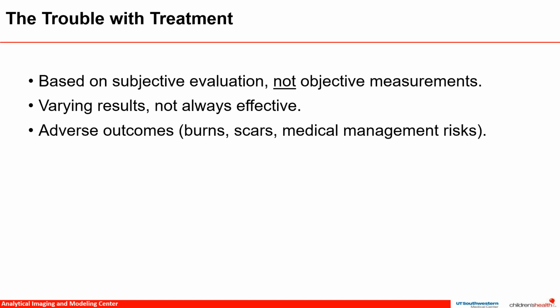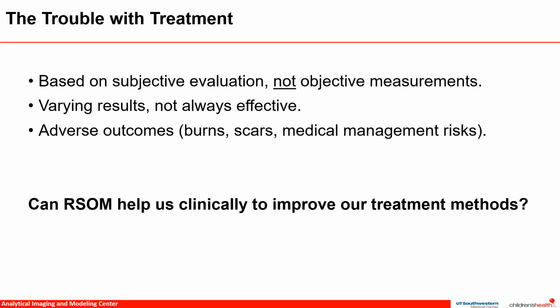Because of this, we sought to gain knowledge about these lesions in an objective way using imaging to see whether we could classify the features of each lesion. Could this help us refine our treatment techniques? Our question was, can Rsom help us clinically in the treatment of capillary malformations and infantile hemangiomas?